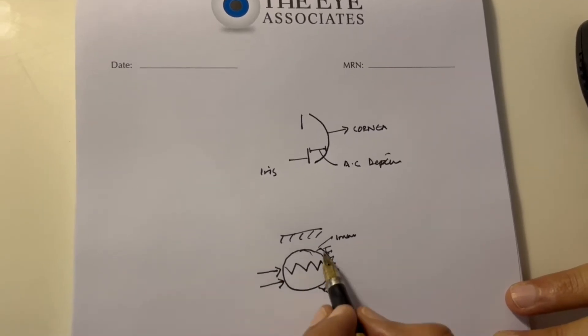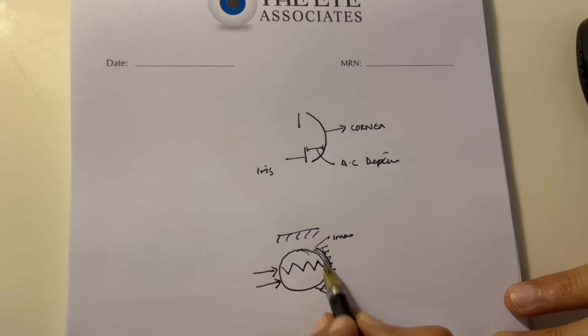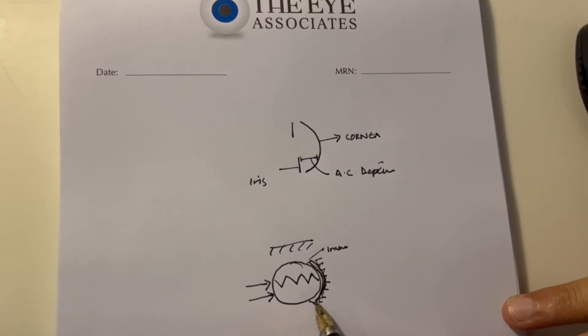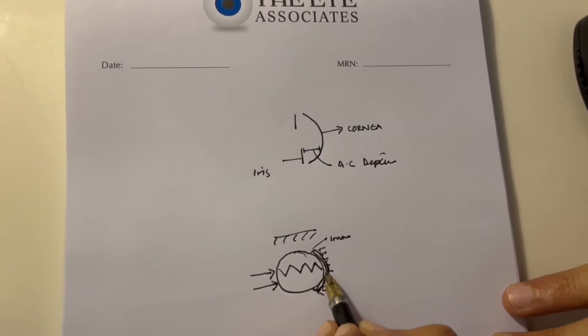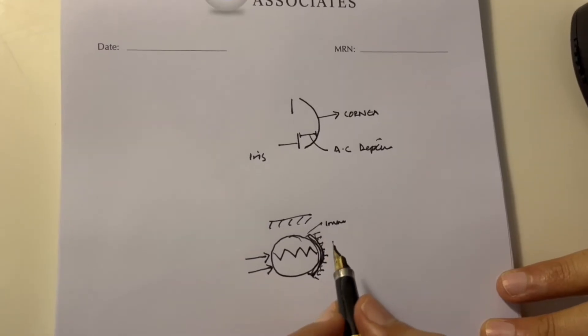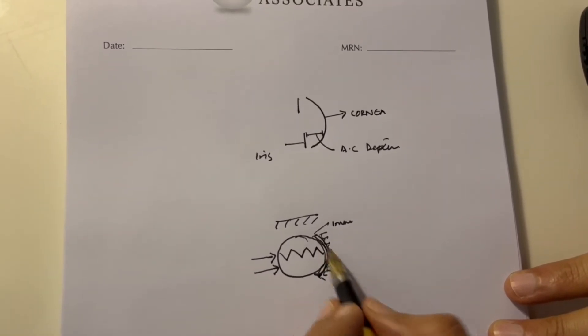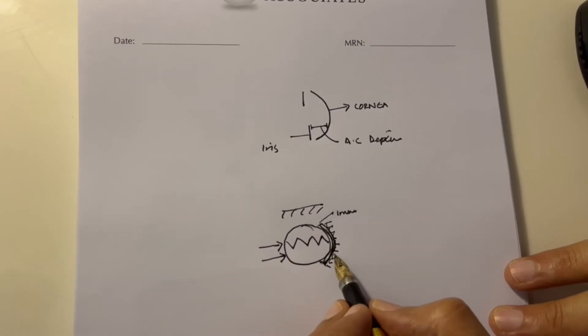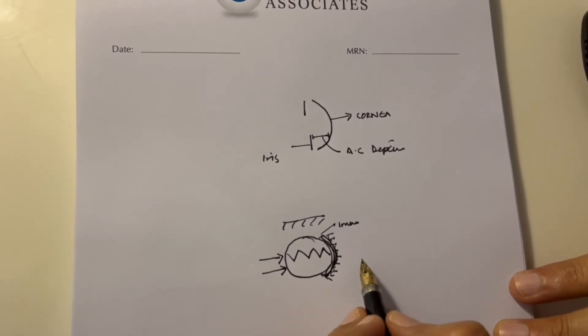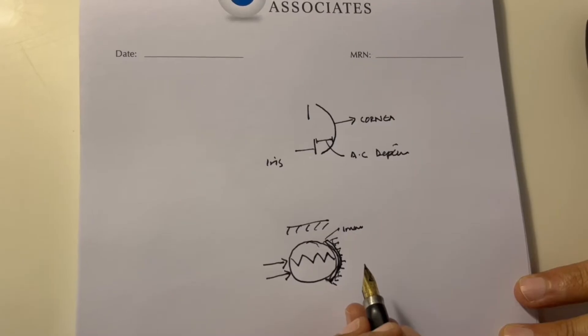If the anterior chamber is shallow, this crescent narrows down. If there's no anterior chamber depth, meaning the iris is in contact with the cornea, this reflected crescent or light won't be present at all.